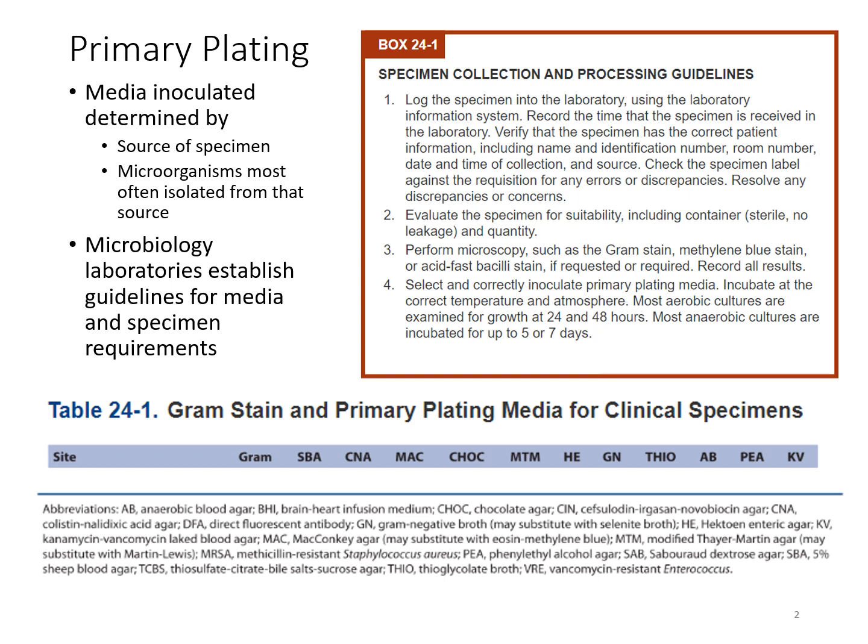But to set up a culture, once the culture is received into the laboratory, it goes through a process of being logged into the laboratory system, whatever that may be, whether it's a handwritten document or through some sort of electronic information system. But various things will be checked for, like making sure that the sample is properly labeled, has the patient's information, whatever identifiers are used for that particular facility, as well as things like the collection date and time and what the source is.